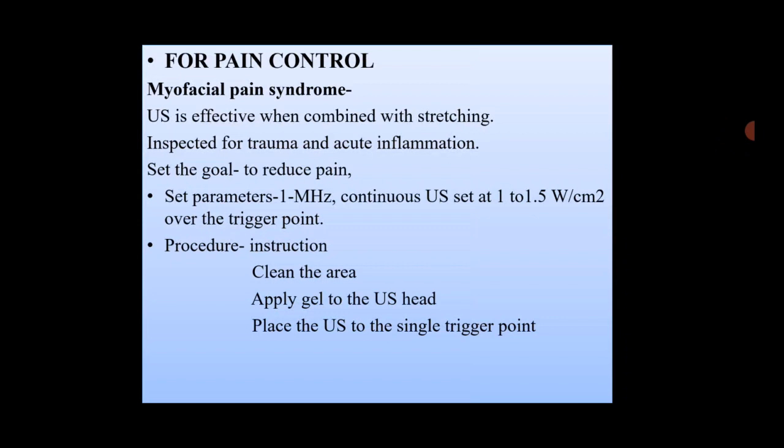For that, first you should know the condition properly and set the goal. What is your goal? Because the patient has pain, your goal should be reducing the pain. So you inspect for any trauma or any acute inflammation and check for contraindications. Then select the appropriate medium, then select the appropriate sound head, and instruct the patient what you are going to do. Clean the area, then set the parameters.